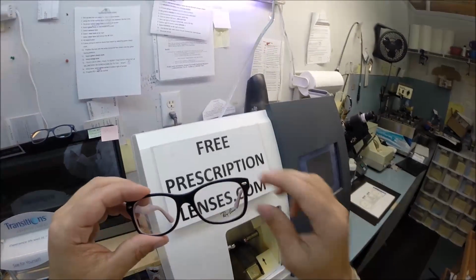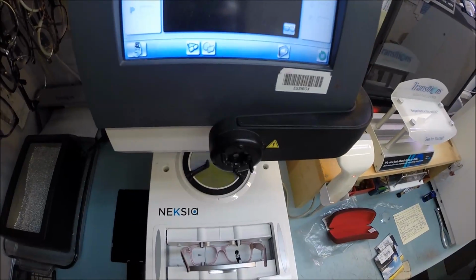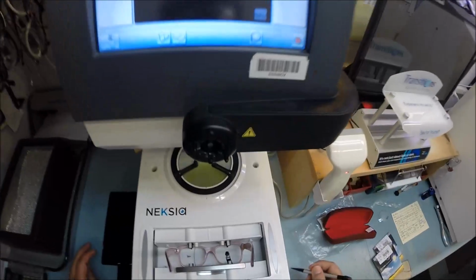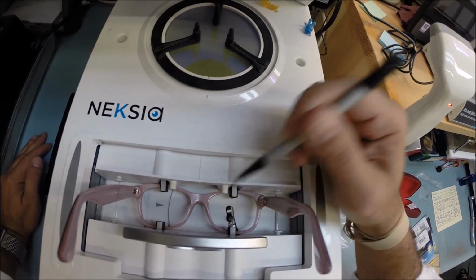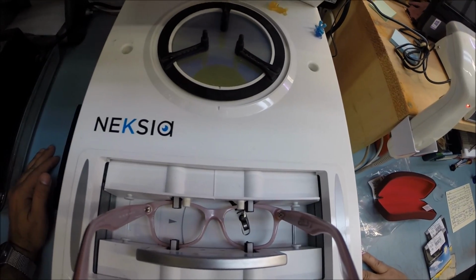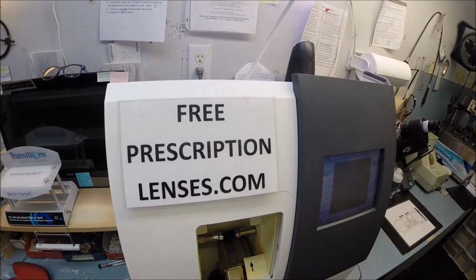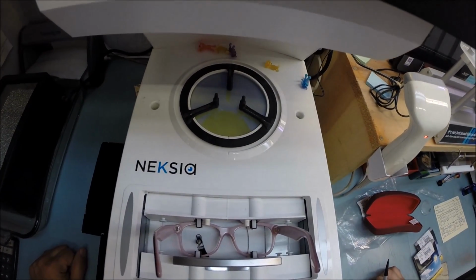This is how your frame comes with the little RayBan logo on the lens, which I will pop out now and put into the tracing element of my edger. And I will adopt the bad accent again. I will hit start. This little stylus will pop up and go around and trace the inside of the right side of the frame before doing the same thing on the left. Here at freeprescriptionlenses.com, where everyone loves a bargain and no one is disappointed with quality.